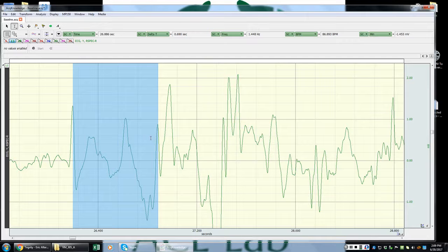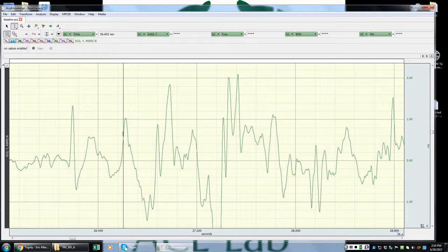So what I want to do is make sure that this is going to be my identified peak. What that usually entails is dropping down certain peaks that are too tall, like this one for instance, and this one, and then maybe boosting this peak up just a little bit. So I'm going to put my I-beam somewhere in the middle of this wave and then highlight it to encompass the other half on the other side.